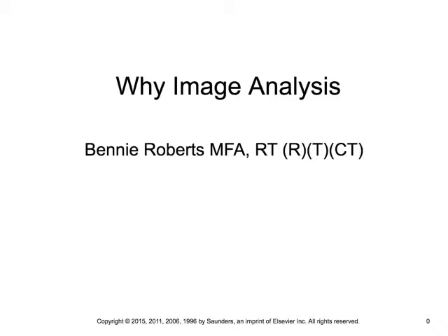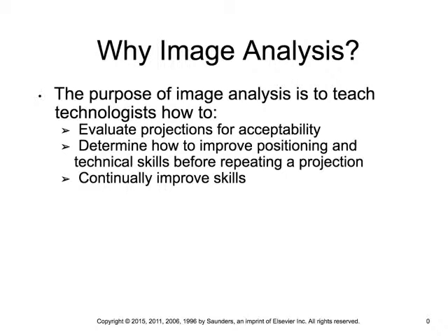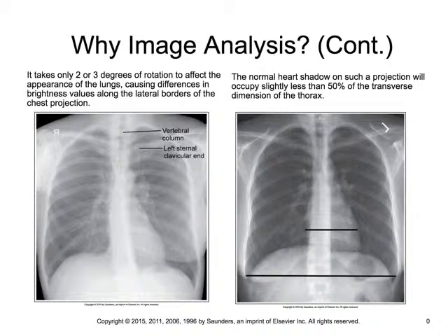Okay, let's spend some time talking about why image analysis is so important for medical radiography. The purpose of image analysis is so that we can understand how to evaluate projections for acceptability, determine how to improve positioning and technical skills before repeating a projection, and continually improve skills. This is a lifetime learning skill that's going to help reduce patient dose as well as give us a way to consistently improve our X-ray images.